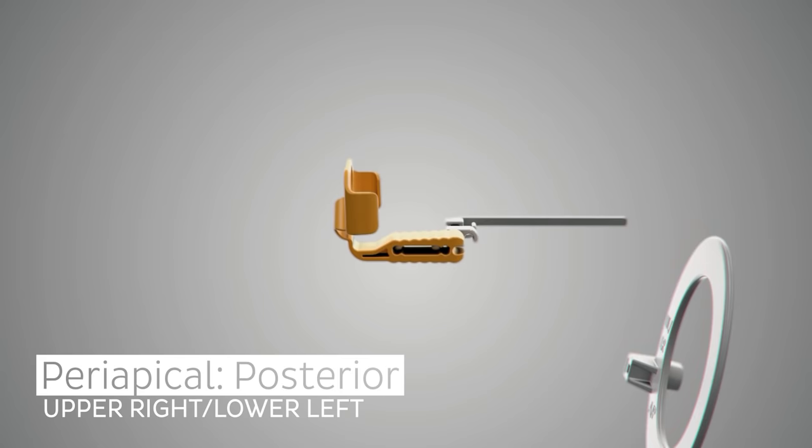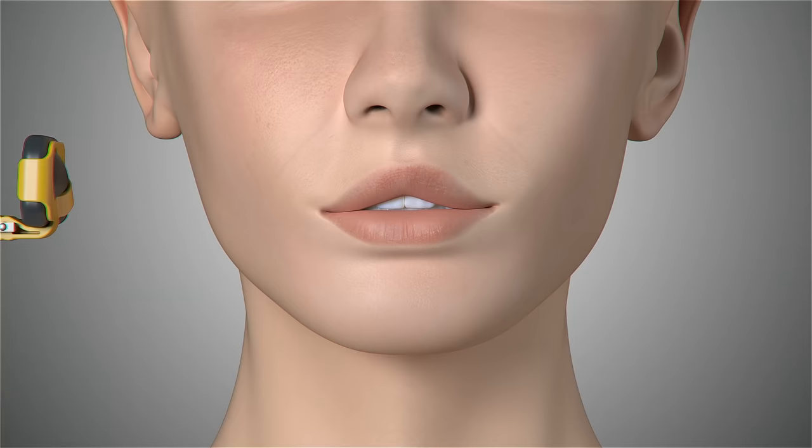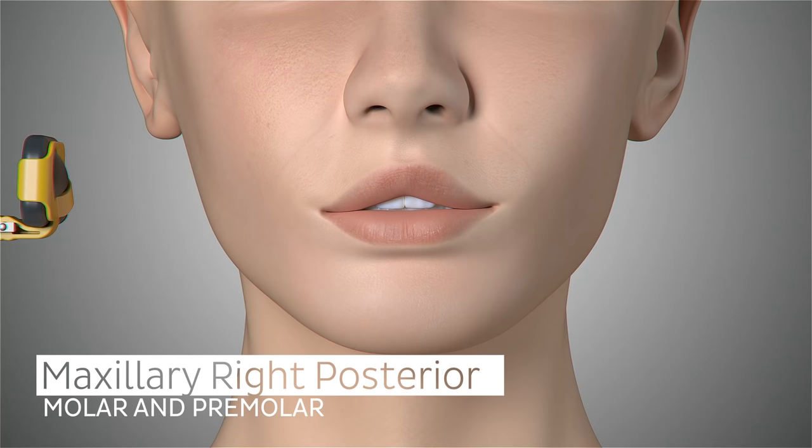The holder setup for this position will include the universal aiming ring, the universal aiming bar, and the yellow posterior horizontal bite block.